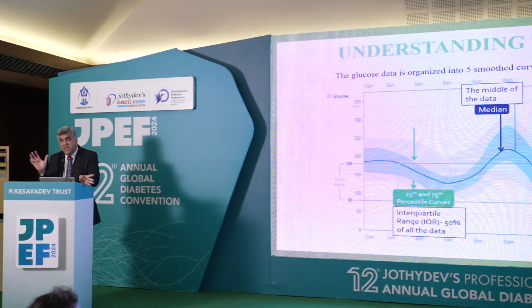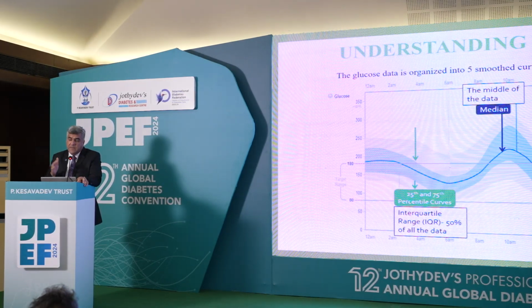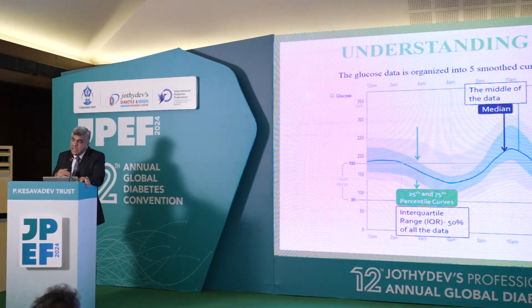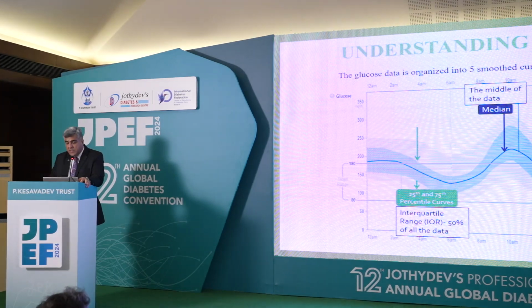And then the light shaded portion means that this has happened only 10% of the times in that period, which is usually related more to the individual's lifestyle, whether it was lack of exercise or more exercise on one day, it was wrong eating or less eating. So that variability, which was less often during that period, is reflected in the shaded portions up and down.